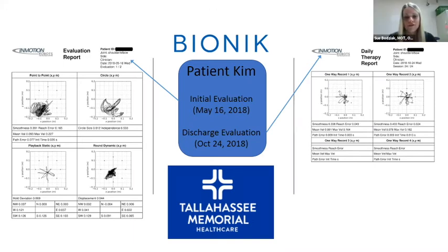So she was really funny, actually, because she became very possessive over the robot. Everyone would laugh about it because she would come to therapy, and if someone else was on the robot, she would say, "Why is that person on my robot?" So I think she really, really enjoyed it because she was able to see her movement. She doesn't have a lot of movement, but she does have some, and to her that meant everything.